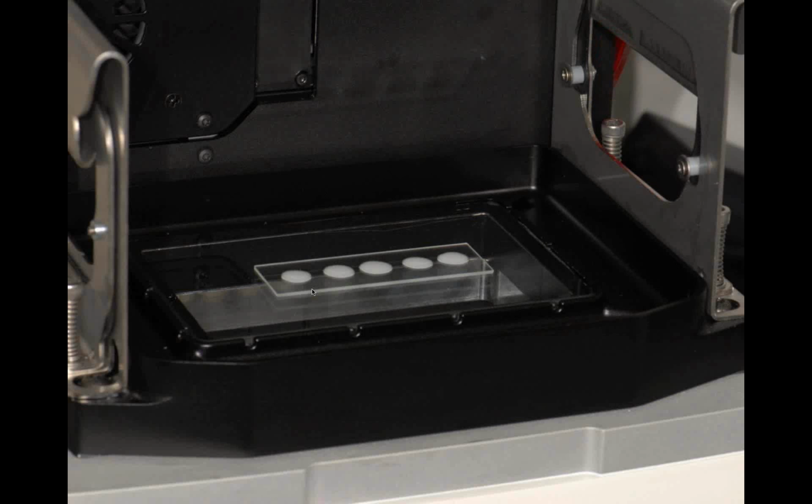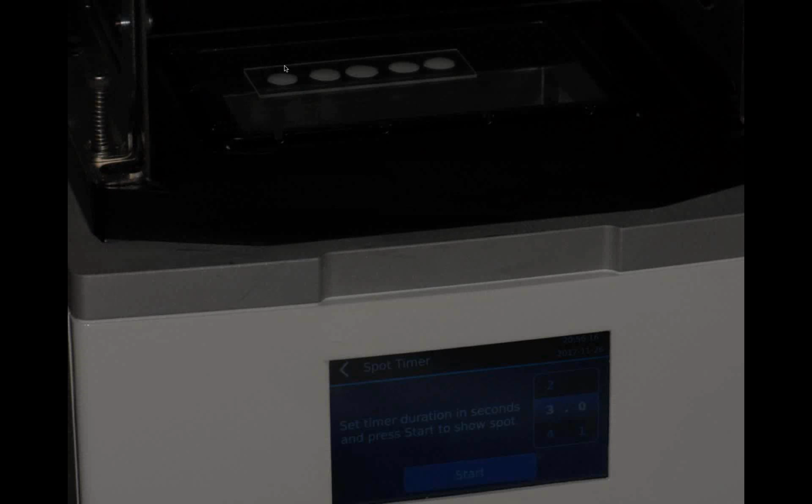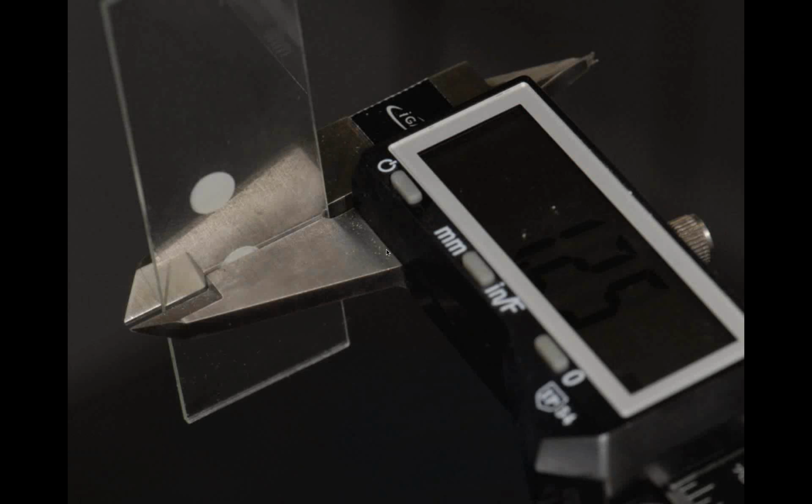So the Asiga lets you put any resin you want on a glass slide, okay? It's got a special function that lets you expose each dot for a preset amount of time. So with this one, you do 10 dots, 2 slides worth. The first one you expose 1 second, the second one 2 seconds, 3 seconds, 4 seconds, all the way up to 10. And what you do is you take those dots and you measure them and see how thick it cured in that amount of time.